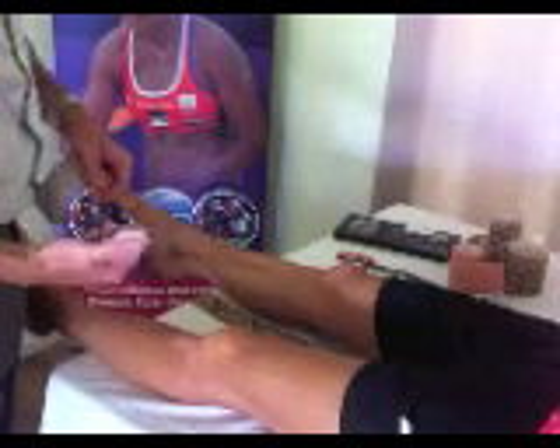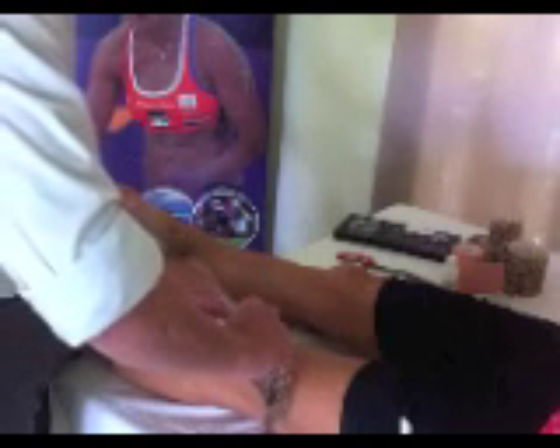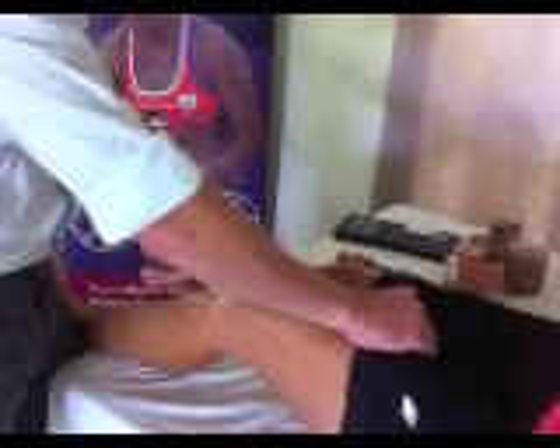Here's a power band made earlier. With these hollow areas, it's generally suggested to use a spray adhesive if you have one, or make sure you hold it down very well and allow adequate time for it to bond. You can also start distally and sweep all the way up — some people find that easier. Just make sure that as you do that you get a nice glide immediately as you come up, giving you that straight line of resistance to lateral translation, which tightens up as they bend and increases resistance to lateral patellar translation.